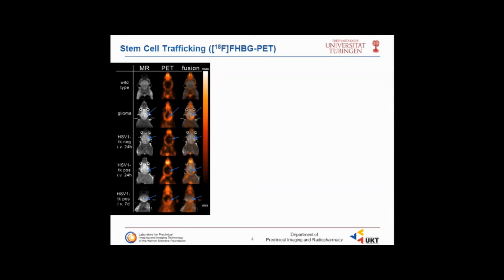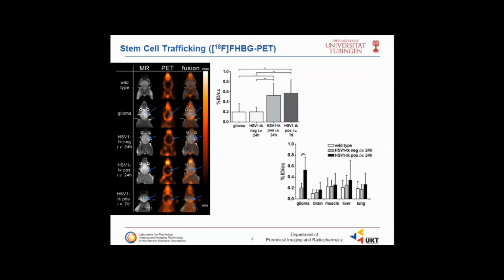So just concentrate on those two PET images. From visual inspection, I would say they look very similar. And if you look over here where the tumor is, you hardly have any signal in PET. However, if you go in and draw your region of interest based on your anatomical image, you see that you have a factor of 3 difference in quantification.